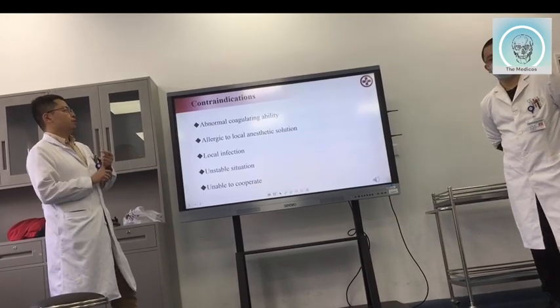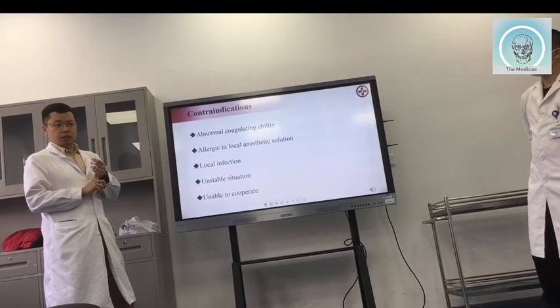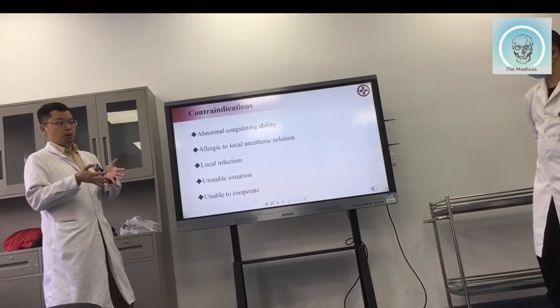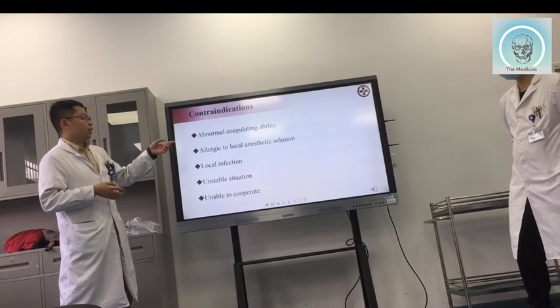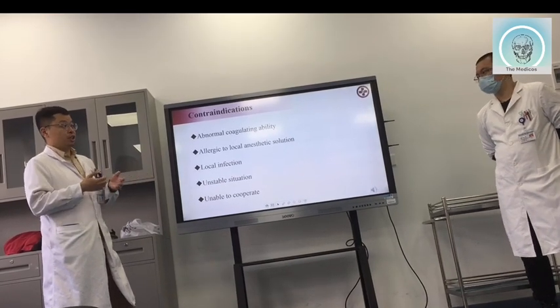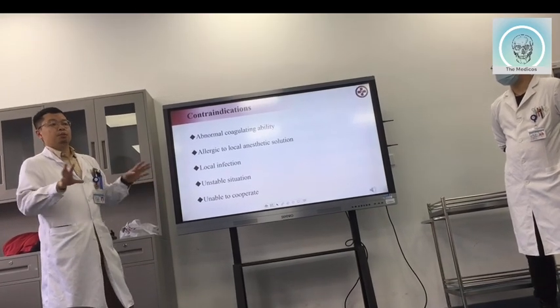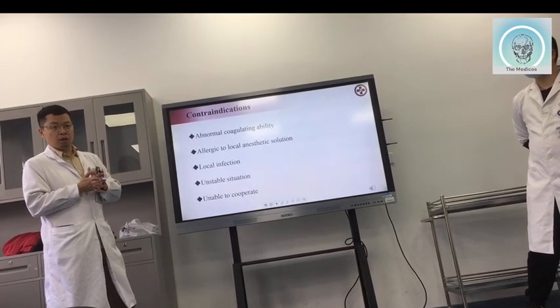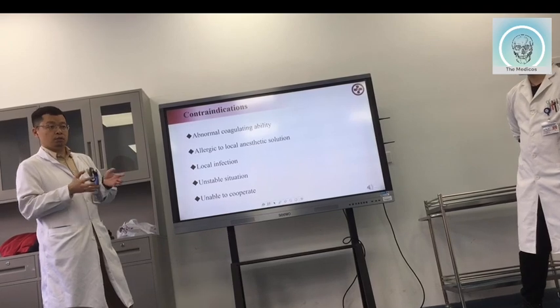Contraindication. First of all, there's abnormal coagulating ability. So if the patient's blood cannot coagulate, then we cannot perform. Because when you do the aspiration... to death, okay. And the second, the allergy to the local anesthetic solution. This also is the contraindication for the other three kinds of procedures you will learn this afternoon. So for all these kinds of procedures, when you will use the anesthetic solution, you should ask the patient, is he or she allergic to this kind of drug, okay?